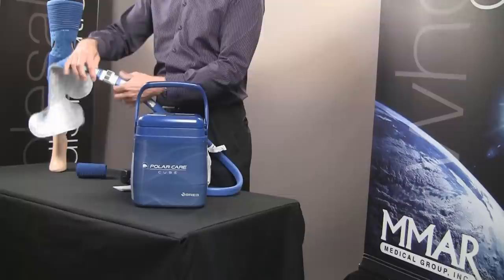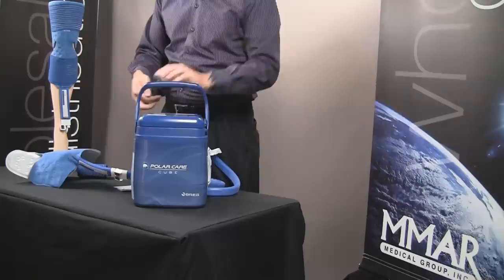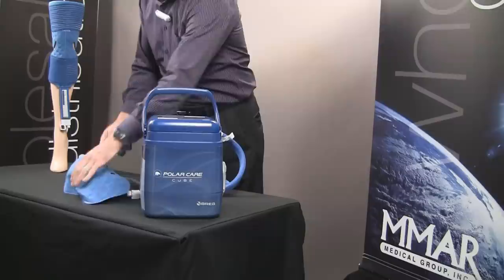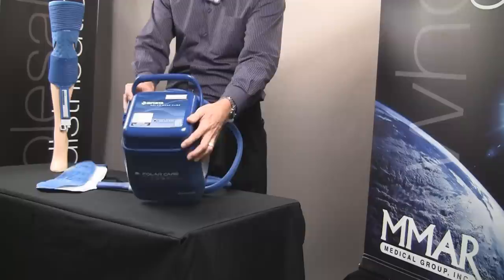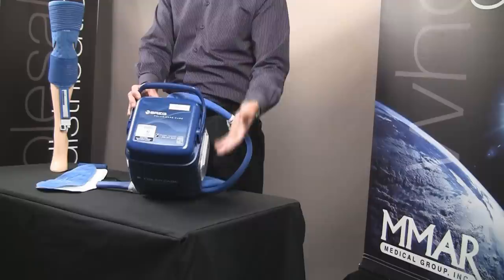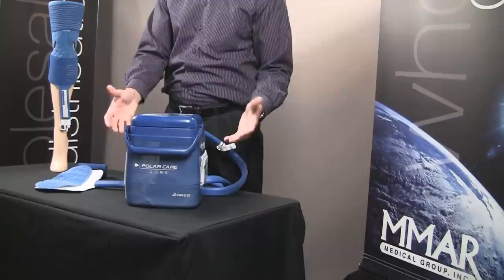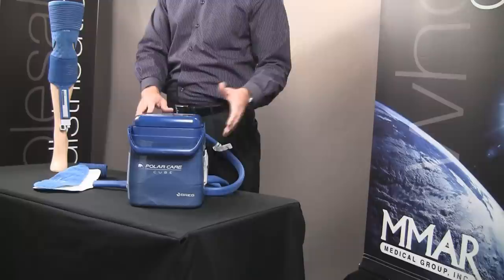Once you've done that, take your power supply and plug it directly into the back of the cooler. There are also other ways to access education on the cooler. You'll notice on this unit there's a QR code — anybody with a smartphone can scan that and it goes to instructional videos. We want to make sure that physicians, healthcare professionals, and patients are all educated on how to use the Breg Cold Therapy line of products. That concludes the introduction to the PolarCare Cube by Breg.